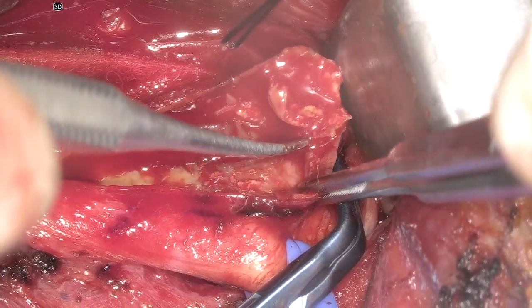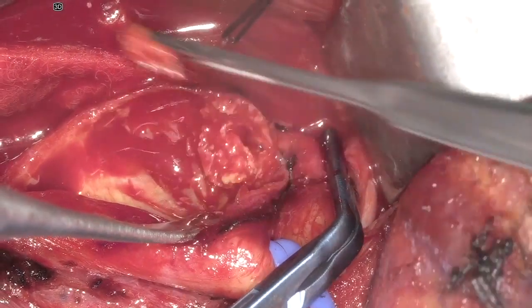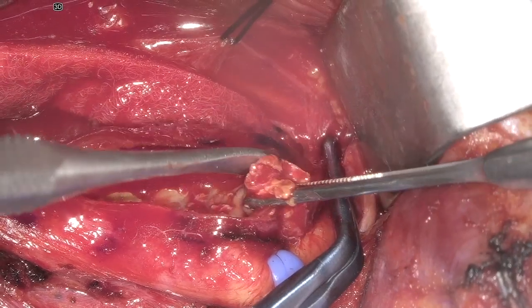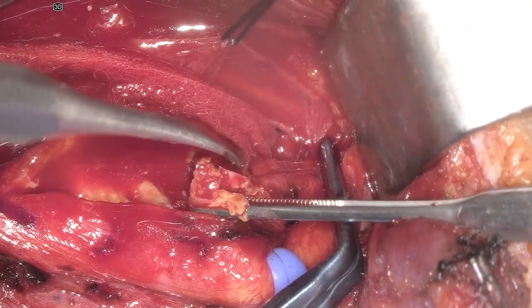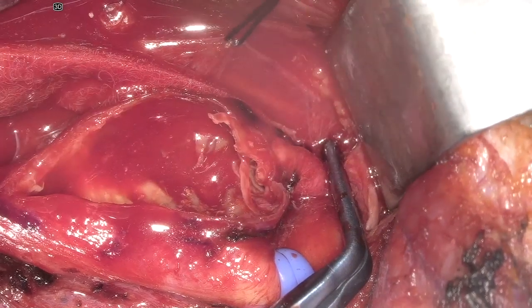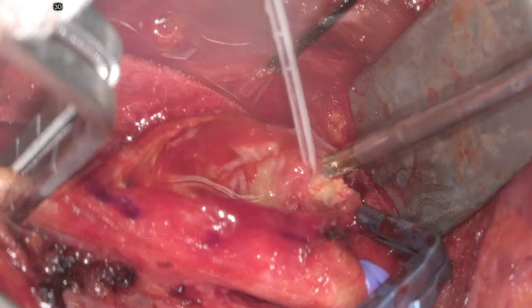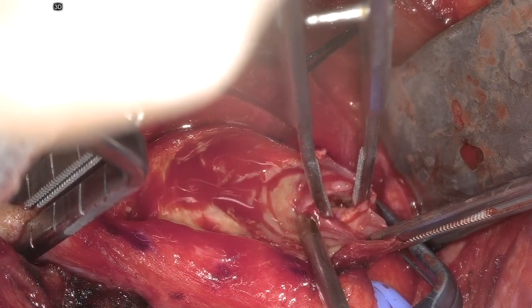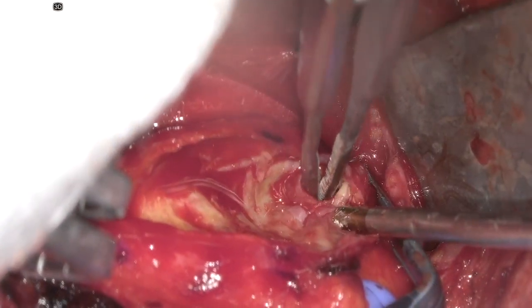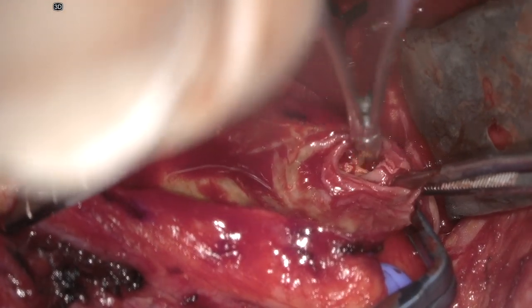Once the plaque comes out, the lumen and all that irregularity is gone. We then inspect the internal. The nice thing with the exoscope is you can angle it superiorly, and it's ergonomic with the surgeons in a neutral position despite looking straight up the vessel. There was a small, very tenacious, hard plaque that I was literally cutting out with scissors.